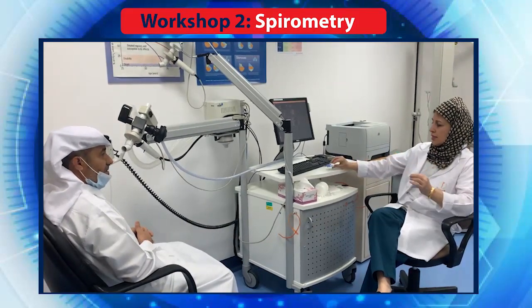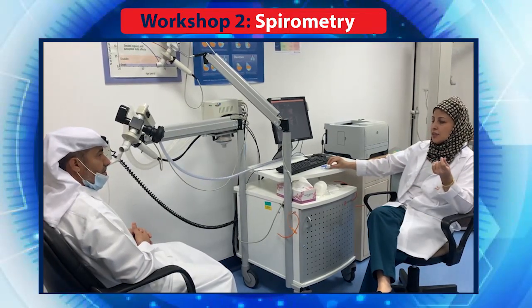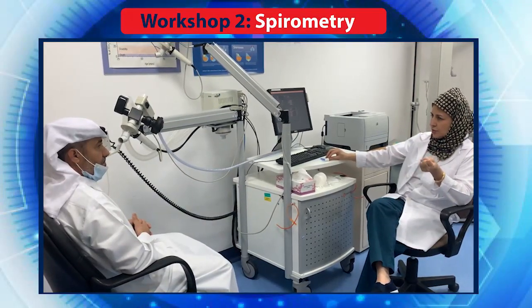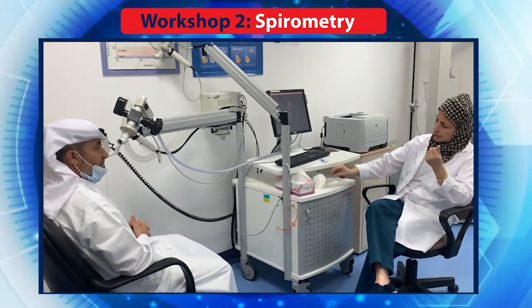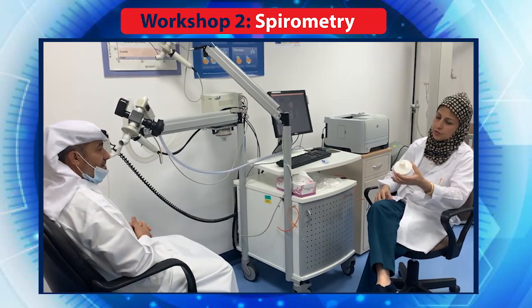Okay, so this test, some people, sometimes they feel a little bit dizzy, lightheaded. So I'm going to have you sitting down throughout the test. All right? Did you take your puffers today? Puffers? Any bukhar? No need. You don't take anything? No. Okay, very good. So this is the mouthpiece that I'm going to give you.